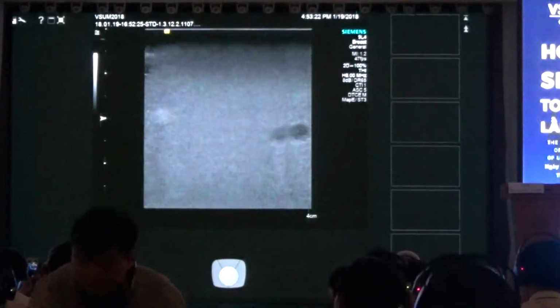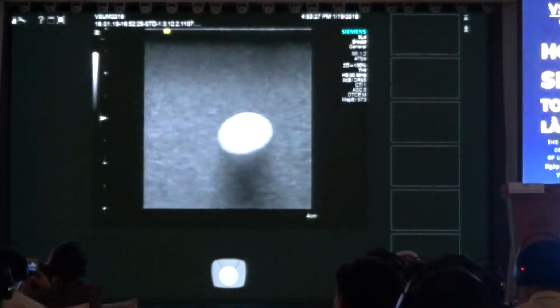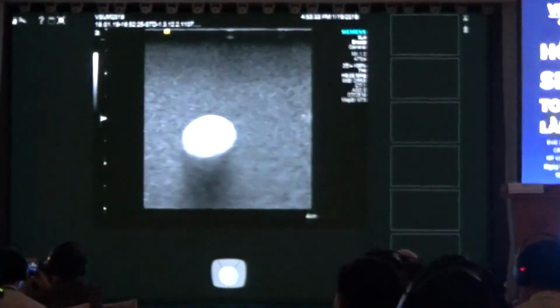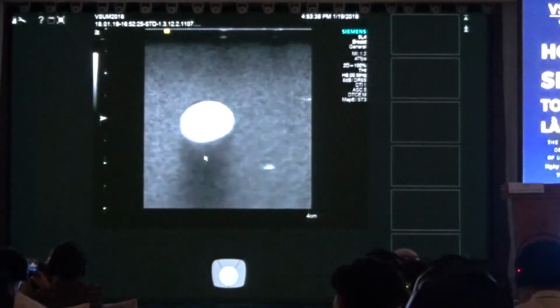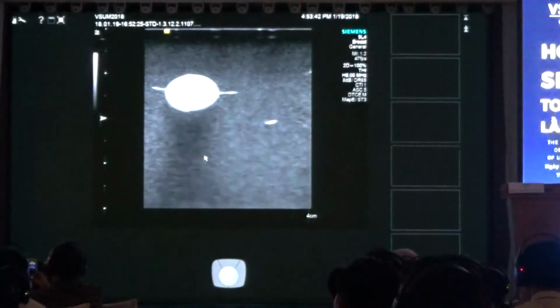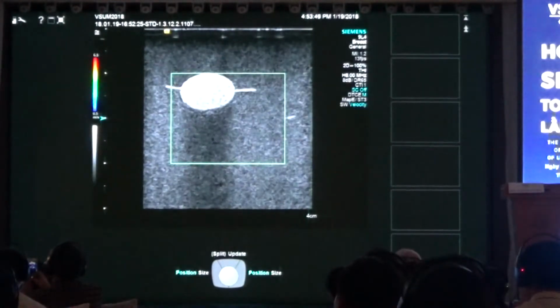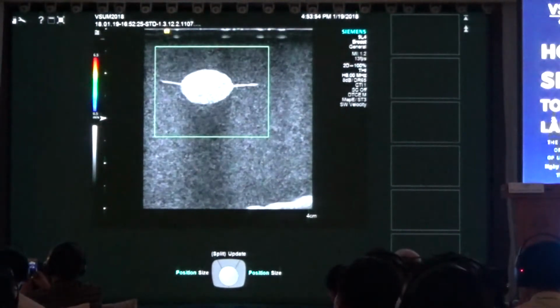So let's find this lesion. So again, we talk about pressure. When I mean by pressure, you can watch the lesion. Let me turn on the pointer. So here's the bottom of the lesion, and watch what happens when I apply pressure. So you can see that I've moved the lesion way up high, and what we're going to do is go into elastography, VTIQ, and let's do a measurement with a lot of pressure.